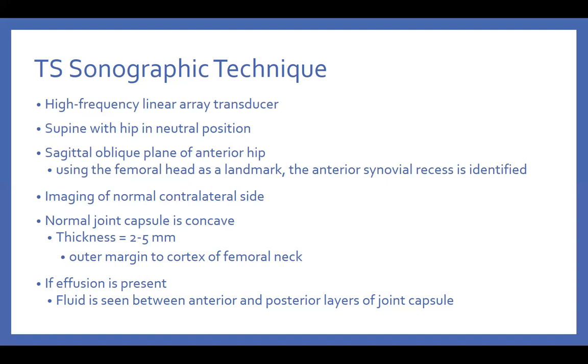Sometimes when we do these ultrasound examinations, we tend not to know the anatomy well. I'm not generalizing, but it can be very difficult if you don't understand the anatomy or the structures that you see on the image. Definitely the landmarks are important, and I will show you an image to go over some of those structures that you will see.